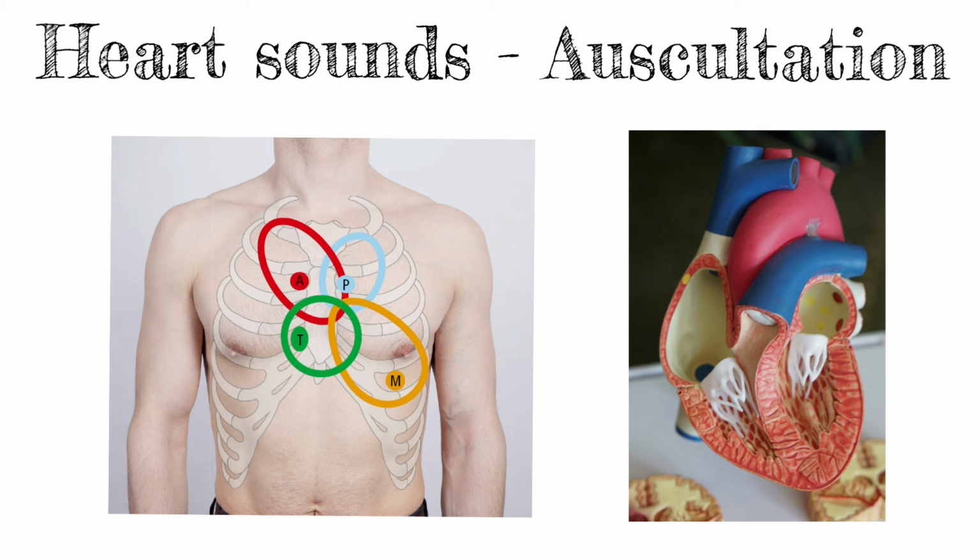Now, you would have noticed on your stethoscope, you've got a diaphragm and you've got a bell. And all the regions of the heart, you will use the diaphragm. And with the mitral valve, you will use the diaphragm and the bell.